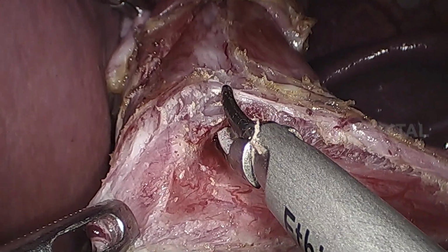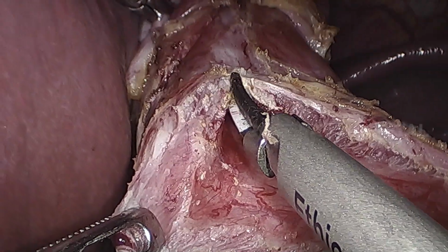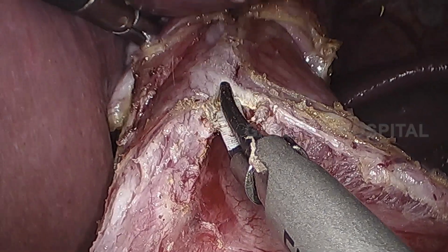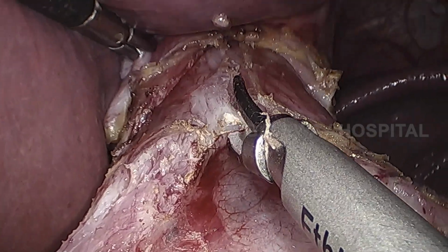So in this case, we actually alternate between a curved dissector and the harmonic shears. The curved dissector is used to create a plane between the mucosa and the circular muscle fiber.